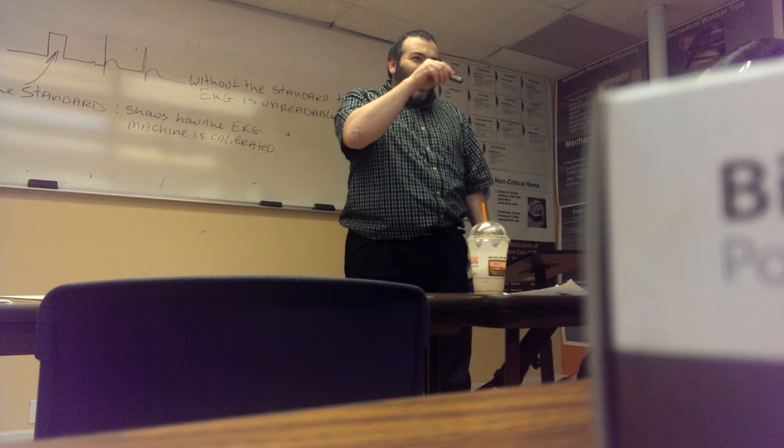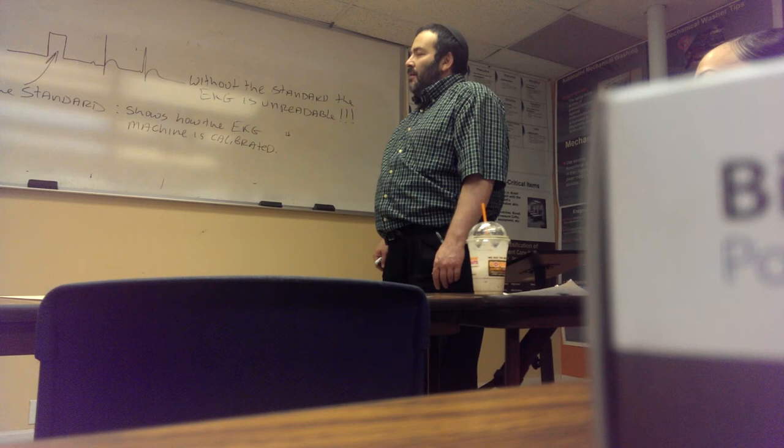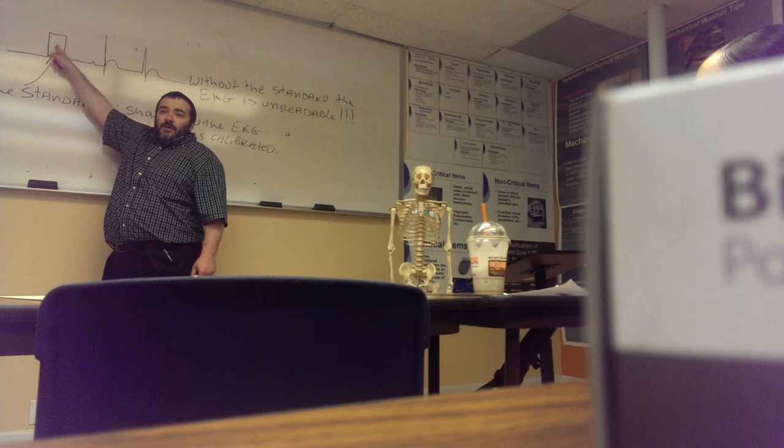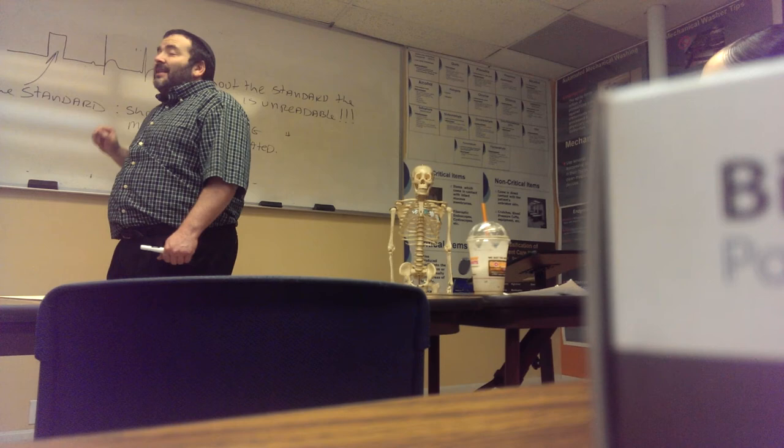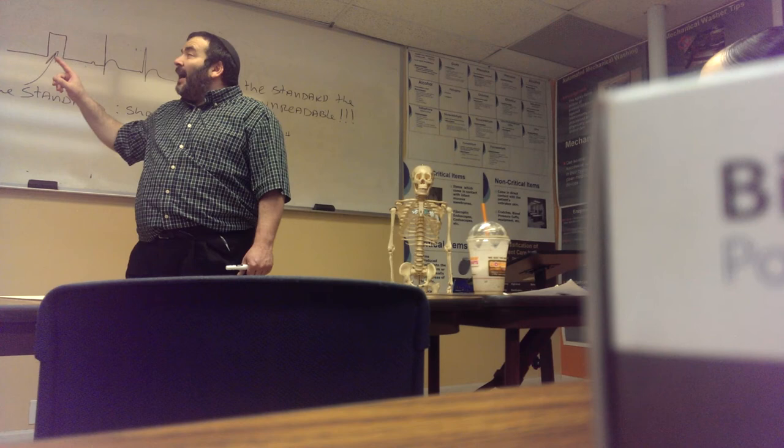Don't break out the pencil and pencil one in. Are you calling that thing that goes up and down the standard? The box. You see this right here? Does that show up on the thing? That's what I kept saying. Our machine does not show this box. It shows numbers. But whether it's a set of numbers or a box like this, it's called a standard. You will see it when you do an EKG.